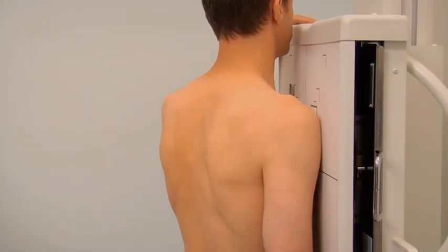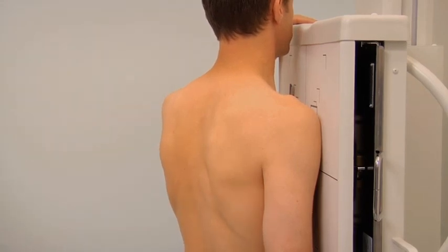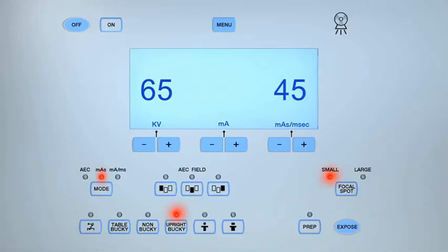For the expiration technique, ask the patient to breathe out and to stop breathing. If performing a breathing technique, adjust the exposure factors and instruct the patient to take shallow breaths during the exposure. Expose the cassette by pressing the prep button, then when ready press the exposure button.